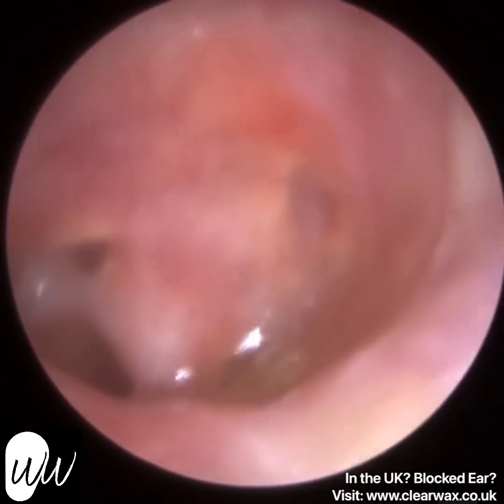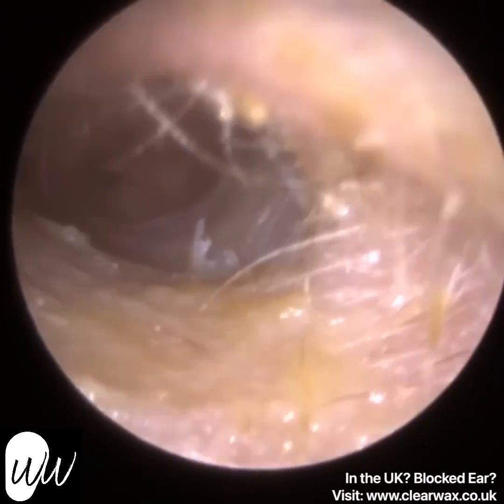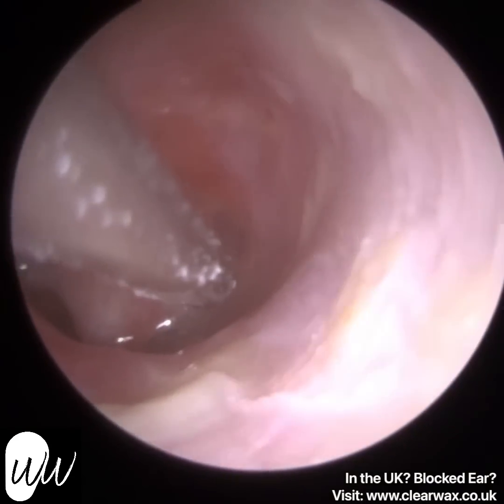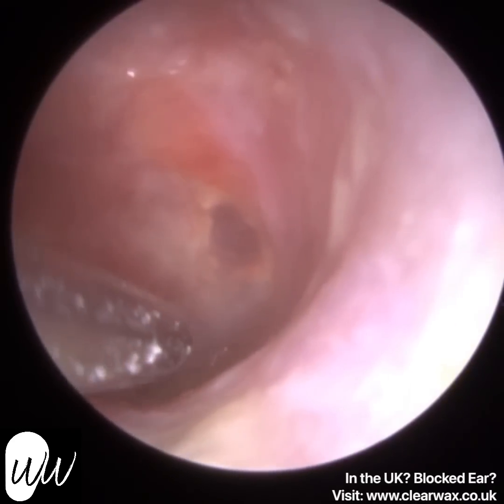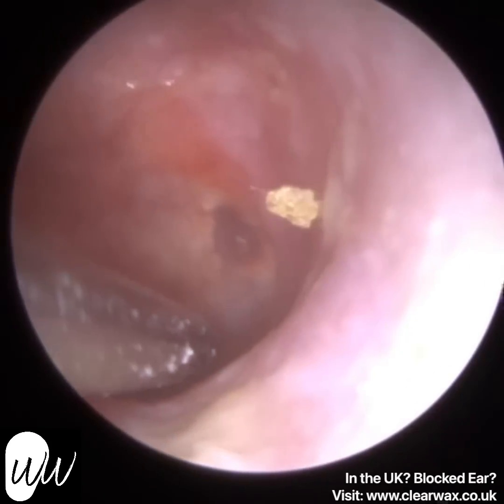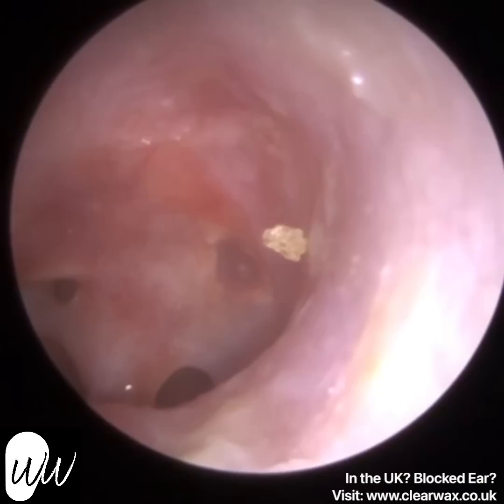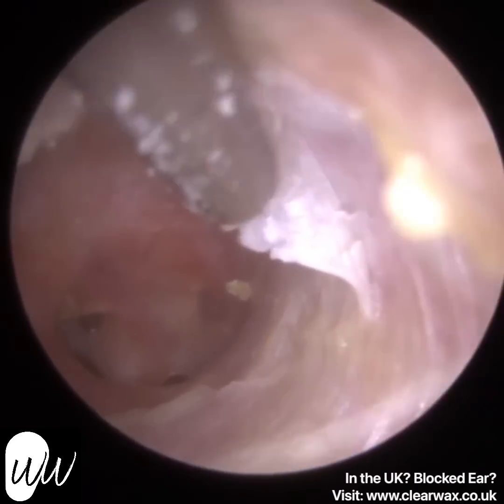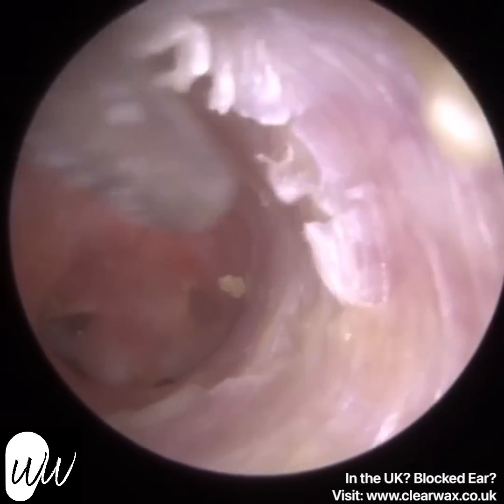As you can see there, the discharge has already formed again, so I'm just going to go back in. It is such a narrow ear canal. Now, because it is narrow, it's actually inflamed, so I would say the patient has got both otitis media and otitis externa. And I'm just delicately positioning the fine end suction probe. You can see when I removed that discharge, it revealed one of the holes in the eardrum. There's still some debris, so I will clear up as much as possible.